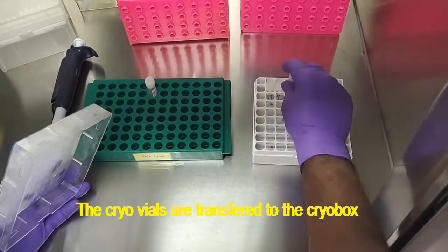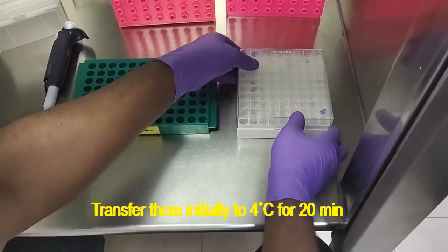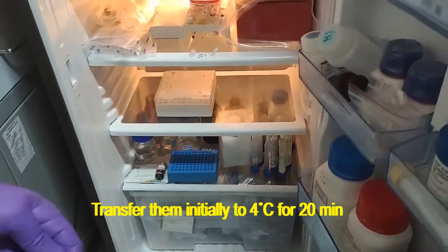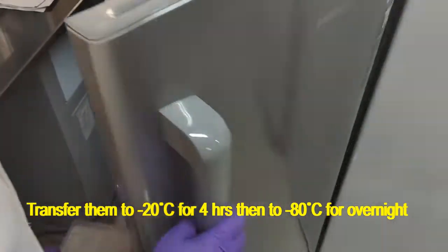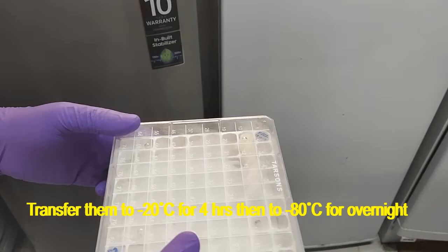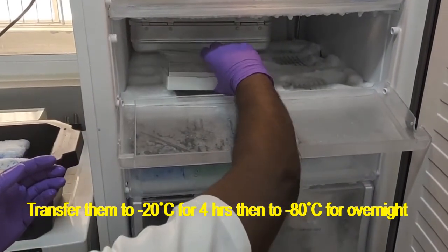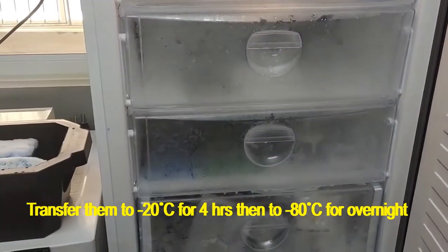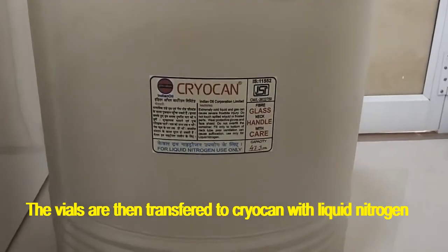The cell suspension needs to be aliquoted into the cryovials and transferred into a cryo box. Initially it needs to be stored at 4 degrees Celsius for 20 minutes, then transferred to a minus 20 degree freezer for 4 hours, and finally transferred to a minus 80 degree Celsius freezer for overnight storage.